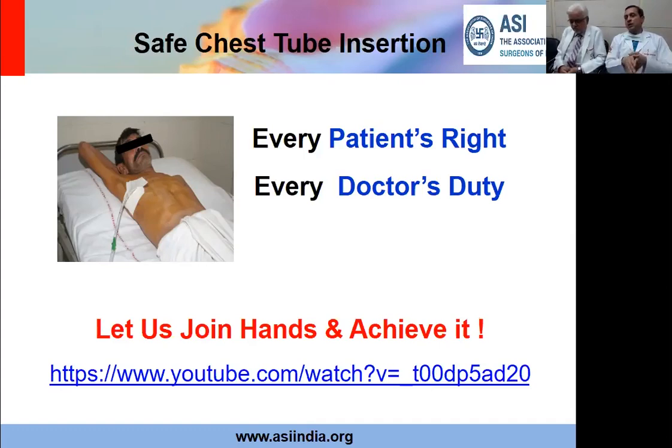Now various international thoracic societies say that if your lung refuses to expand per primum after putting a chest tube, or it expands but your air leak continues beyond 7 to 10 days, then that's an indication for exploration, thoracoscopic or open, because then they will have a bleb or a bulla or something which is leaking out. This is in a situation of pneumothorax.